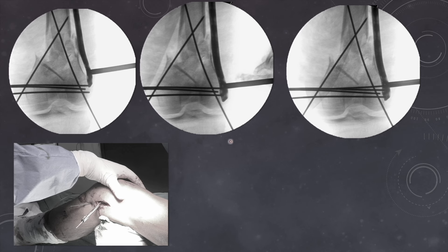Now check whether the plate has been positioned properly. We want the hole of the last screw to be at the correct level. A locking sleeve should always be placed in the terminal part of the plate, because that will help you in sliding the plate in a downward or upward direction. Once you are satisfied with the position of the screw hole, you can pass a drill bit or a thick K-wire through this sleeve — that will help in securing the plate position in correct relation to the articular block. We have placed a 2.5 mm K-wire, so the distal portion of the plate is now secure.